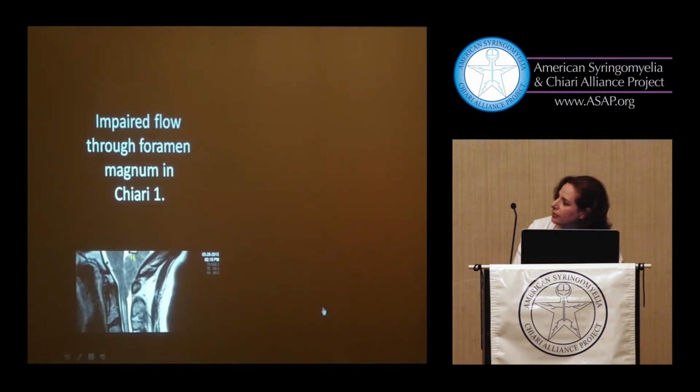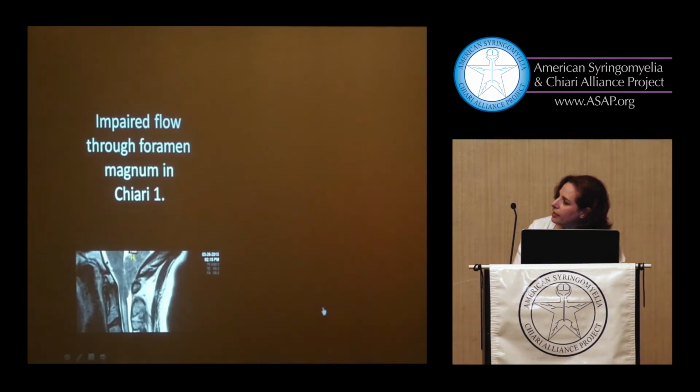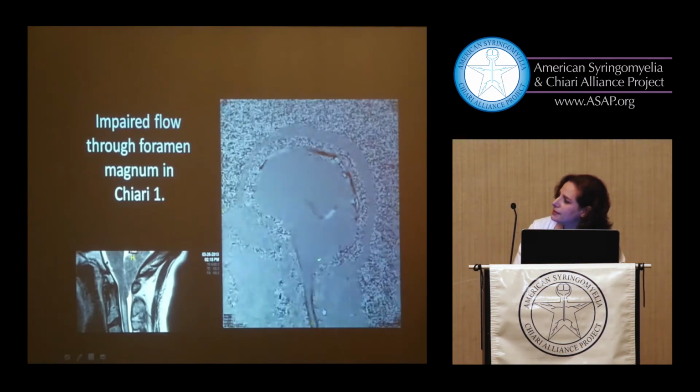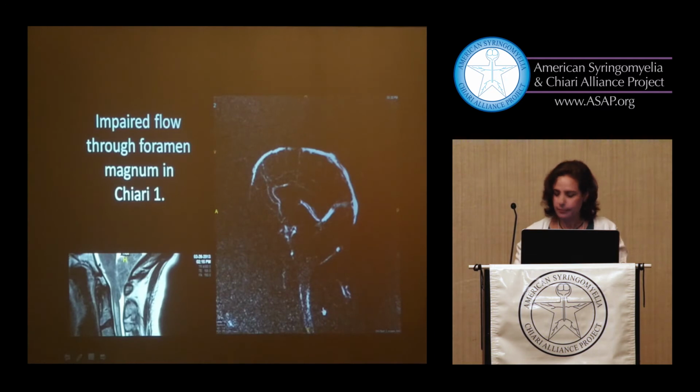And if you look, this one's going to take a few clicks. Again, there's flow in front, but stopping over here. So there's something abnormal about the flow. And in this case, 1 year later, the patient, let me just show you that. This is another way of looking at the same flow, by the way.